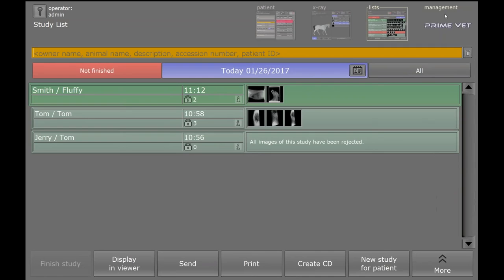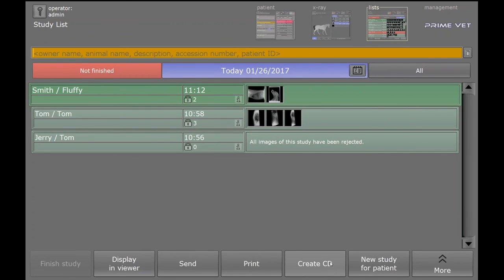When finished, click back. And just like the human software, you can send, print, create a CD, and that's it.